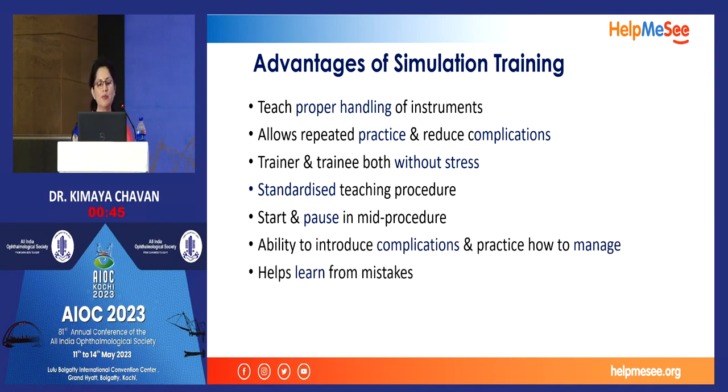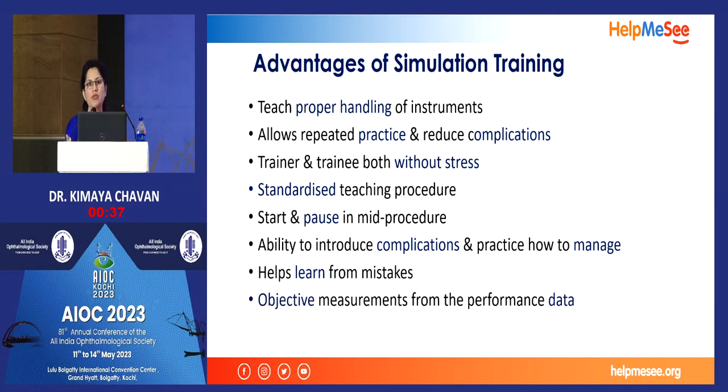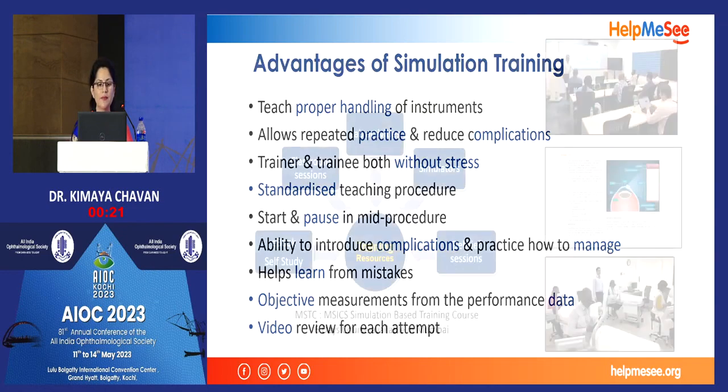You can pause in the middle of the procedure, which we cannot do in live surgery. Then, of course, the complication rate is reduced. Studies have shown that among those who trained on the simulator and then went to live surgery, the complication rate in patients was reduced by a minimum of 50%. So it's very helpful. And of course, you can review your own video after the surgery is over, so you can detect your own mistakes.